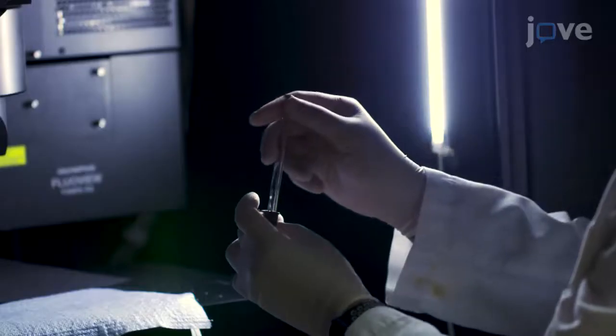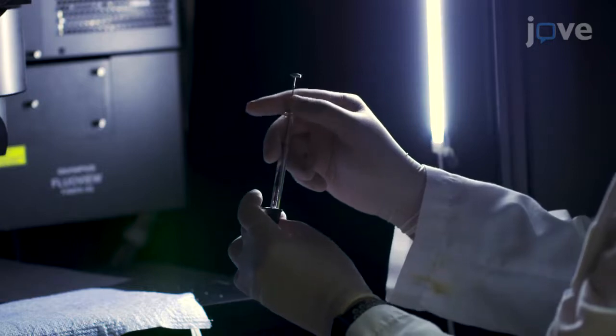Breathing moves the paw over time, causing blurriness and a loss of the focal plane. Be sure to affix the paw firmly with tape to a stable surface before imaging.